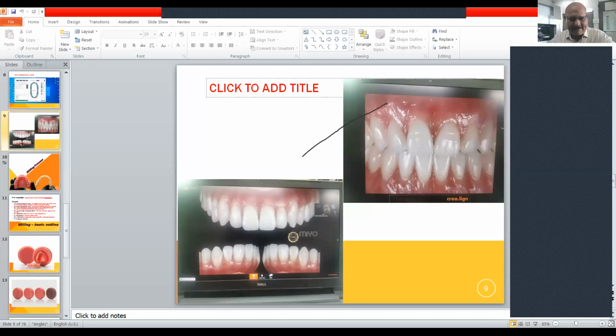A hybrid denture would be more efficient if the crown height space is good enough. But if it is less than 14 mm, then maybe we can think of giving a screw retained FPD model. Yes, we can design that also. Why not? We can have a screw retained PFM sort of. Just screw in the whole framework, and the PFM is layered with porcelain. So we can mill that framework in cobalt chrome, because titanium is tough to bond with the porcelain.